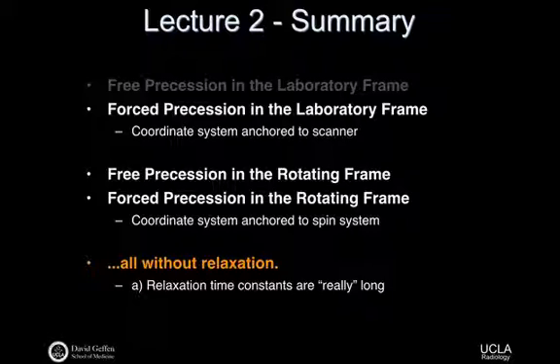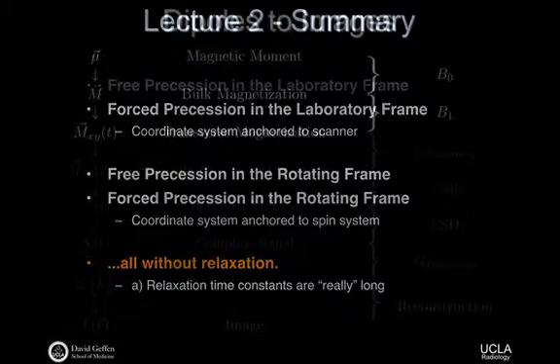So I think maybe something got cut off on the bottom there. Yeah, there were 2 reasons for this, right? Relaxation time constants are really, really long, so there effectively is no relaxation. Or the other one is that the event time scale we care about is just a lot shorter than those time constants, the 2 different extremes.